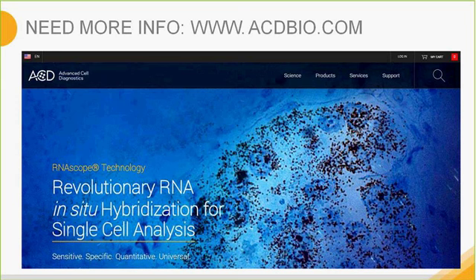Another question is, I still have leftover pretreat 1, pretreat 2, and pretreat 3. Can I use them with my 2.5 kits? The answer to this is no. RNAscope 2.5 HD has been optimized with RNAscope hydrogen peroxide, target retrieval, and protease plus, as well as protease 3 and protease 4.